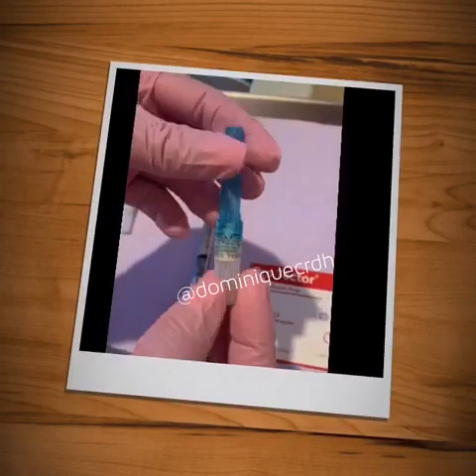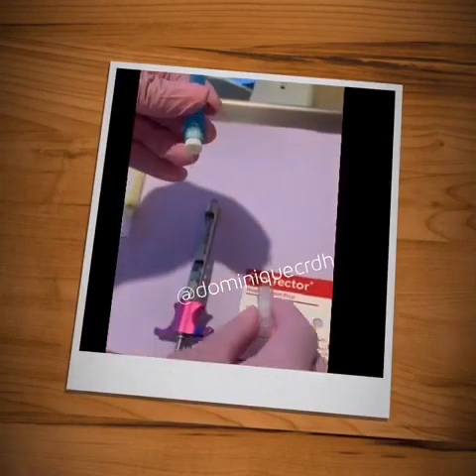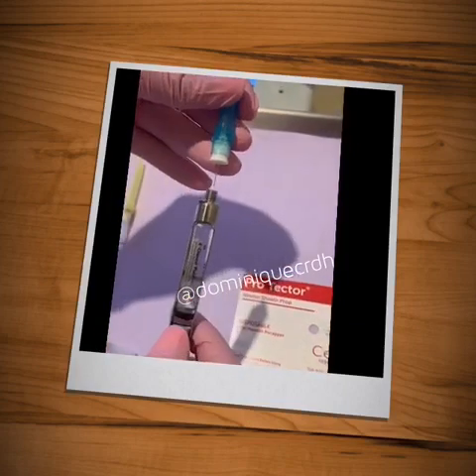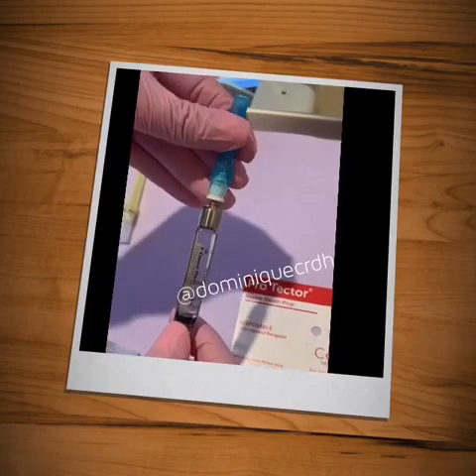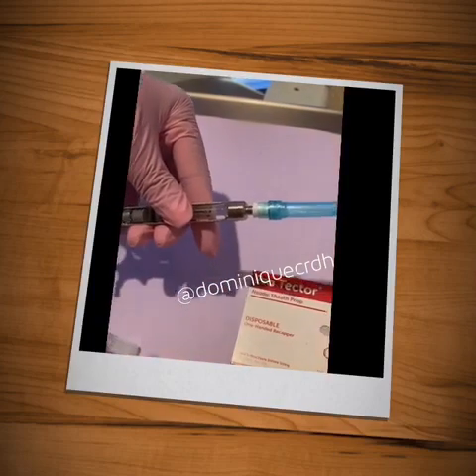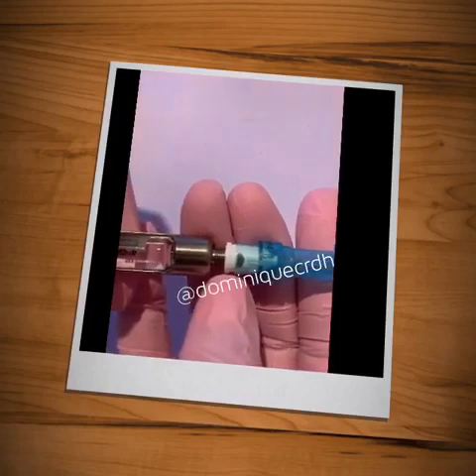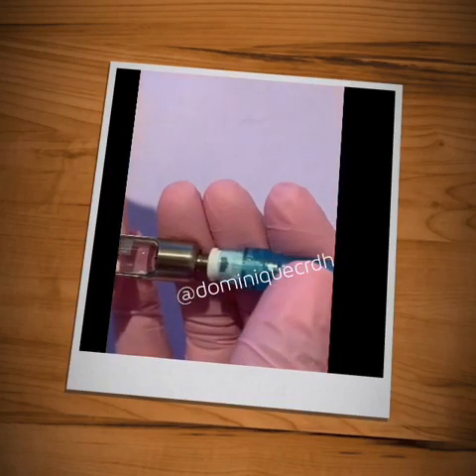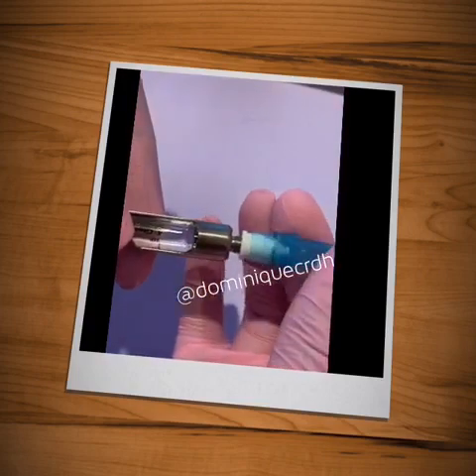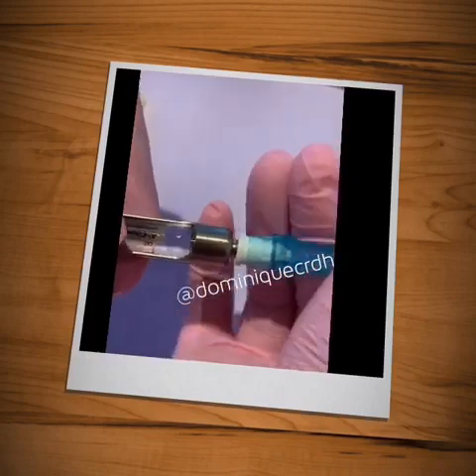After I've loaded the carpule of the anesthetic into the barrel of the syringe, the next step is to attach the needle. So you want to go ahead and twist off the cap and use the needle adapter to attach the needle, twisting it onto the needle adapter, making sure that you are aware of where that indicating arrow is. As you are twisting, you want to make sure that the indicating arrow is opposite the window of the syringe. Twist until tightened. When you are done twisting, that indicating arrow has to be opposite the window of the syringe.